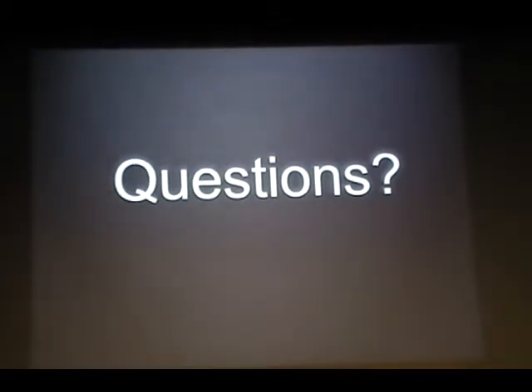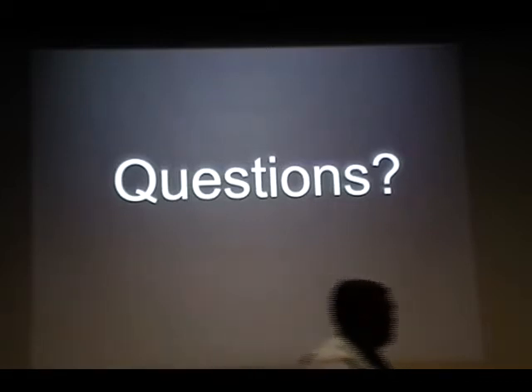Questions with this particular one? Oh my God, we spent 2 hours for this? How do we know when we're supposed to capture the apex and when not? Because some of those have it, some of them don't. Remember, for bitewings, we don't capture apices because you want to see only the interproximal areas. That's it. For all PAs, periapical radiographs, that's where you need to capture the apices. Any questions with that?